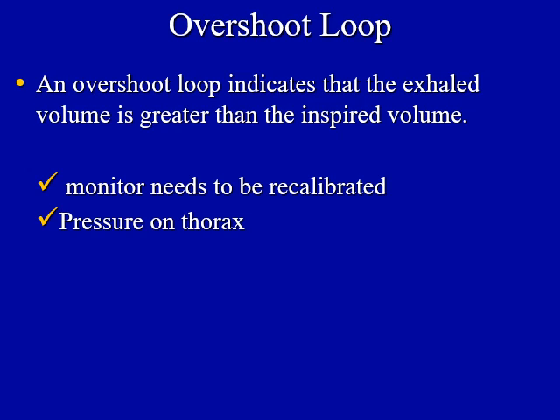It occurs whenever a surgeon is operating and there is pressure on the thorax. Then the air present in the lungs is exhaled in addition to the exhaled tidal volume, because of the pressure.